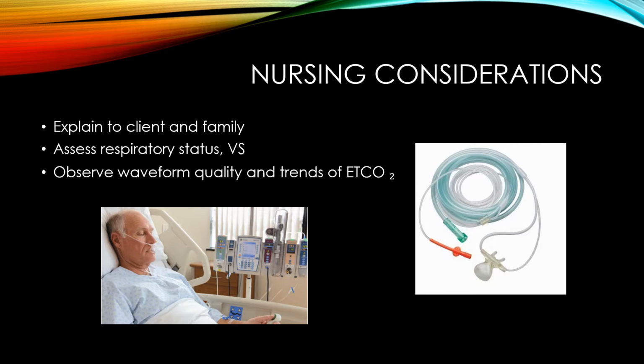Also, make sure you get a full picture of your client's respiratory status, which means getting a full set of vitals, still getting your O2 saturation and end tidal CO2 readings, and observing waveform quality and trends of end tidal CO2 readings, just to make sure that there is not a change in your client's status.